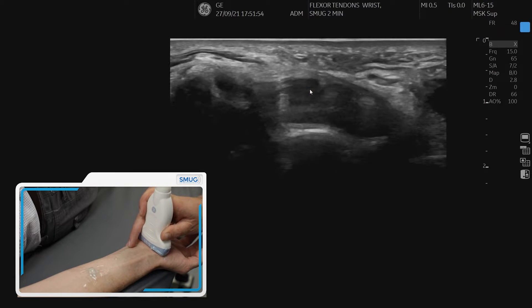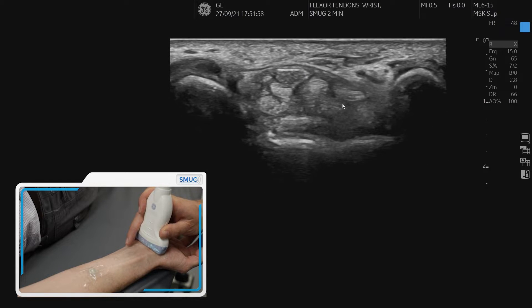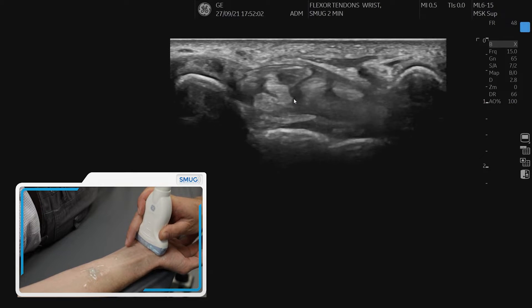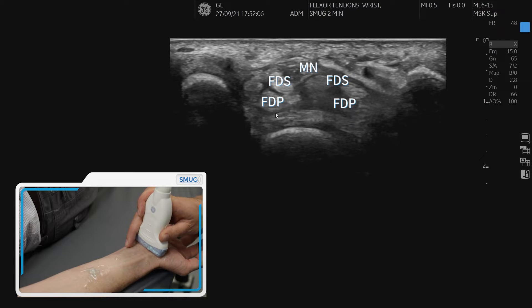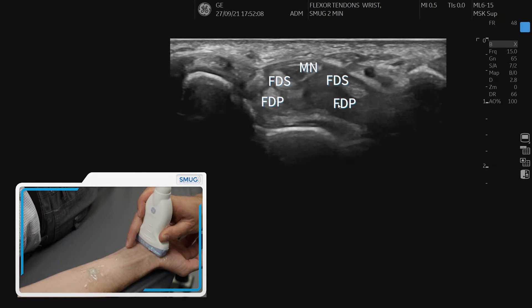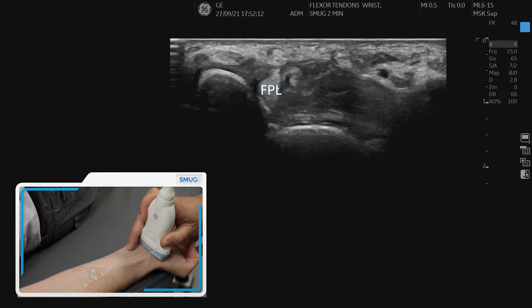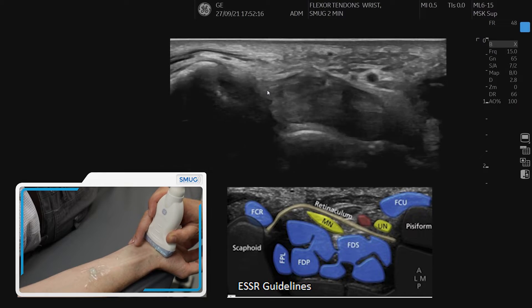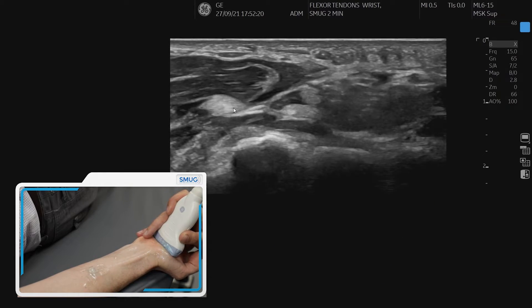Going slightly more proximally, we can see the nerve, and underneath it we can see lots of tendons. If we get the patient to wiggle their fingers, we can see we have flexor digitorum superficialis in the more superficial layer and flexor digitorum profundus deeper. We also have another tendon sitting just underneath in the corner here, which is flexor pollicis longus — and we can follow that all the way into the thumb if we want to.